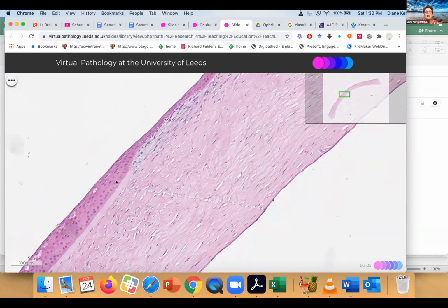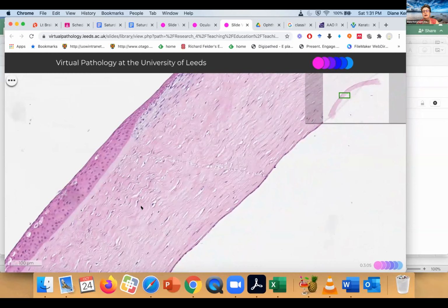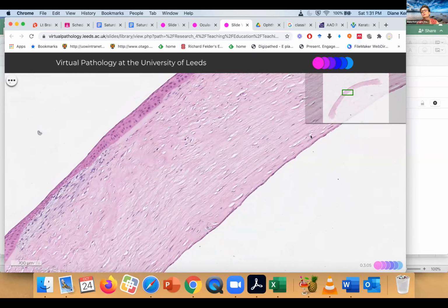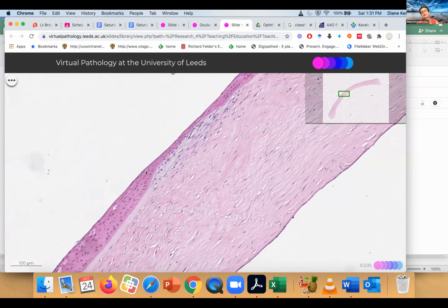Oh, here's another artifact. That it wasn't herpes. Like herpes can make scars. It can make scars and can give ulceration, and sometimes the grow back can be that. So if we're thinking of herpes zoster, I would look along here at the basement membrane for little granulomas if it was healed over and not acute.